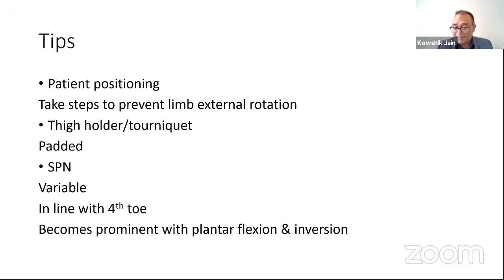If it's not properly padded, it can give rise to some very undesirable pressure effects, skin necrosis, nerve damage, and you don't want that to happen. So it's a must that the thigh holder is well padded.